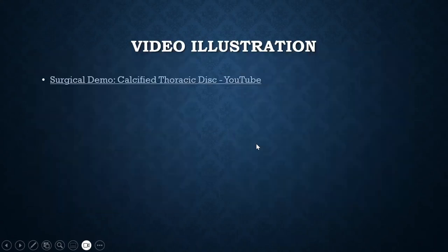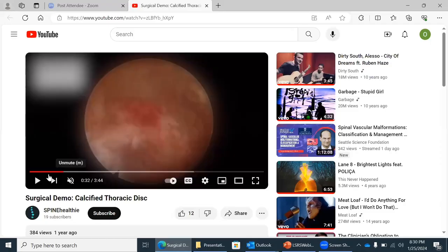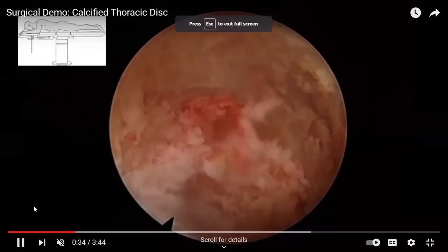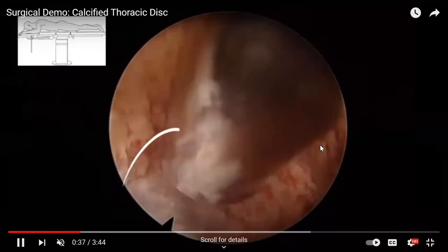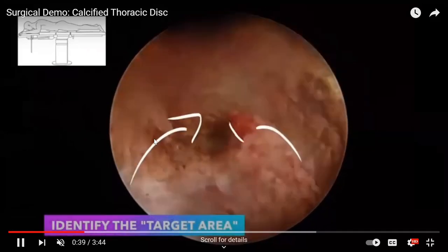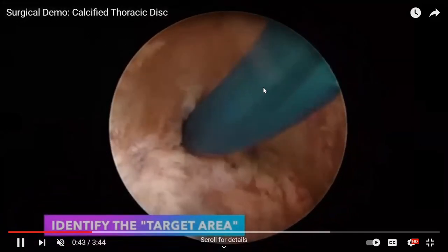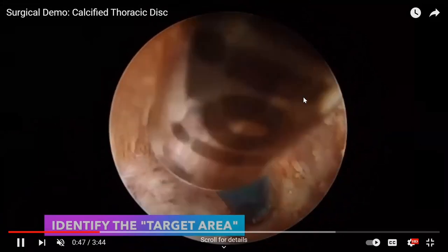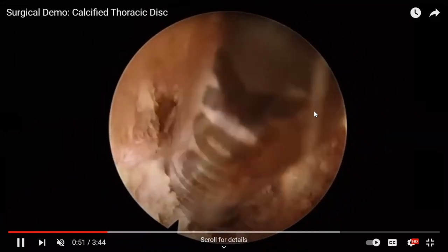So I have a video here that I'd like to show. It's going to be a quick video, and I'm going to scroll through it. So you put your working channel in and you put your scope in, and what do you see? This is a video by John Ugalde at WashU, great video, and he usually has great videos. On the right side here is the pedicle, and then it goes up into the superior articulating process. And you see the reamed bone there.